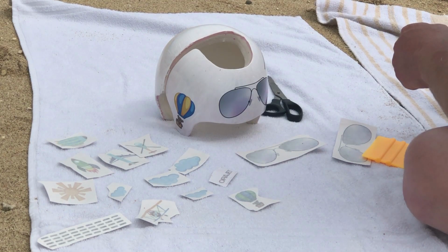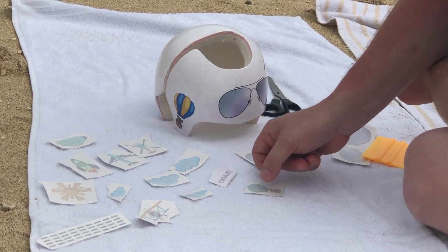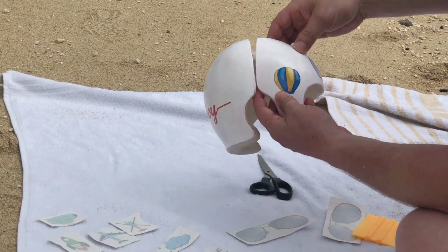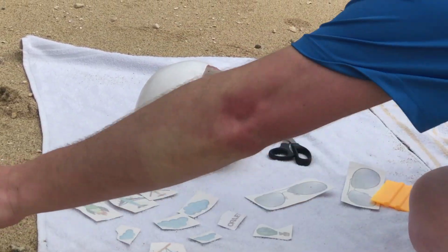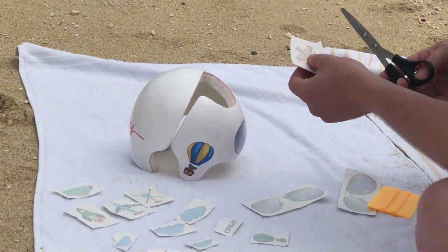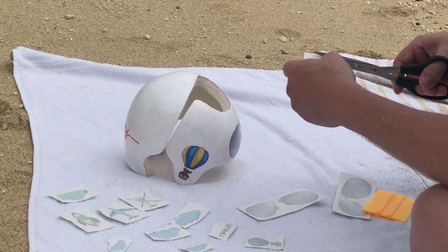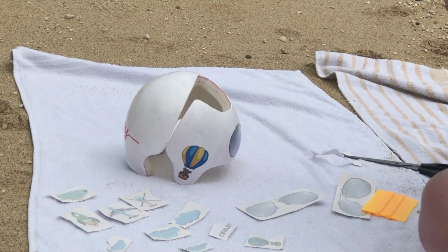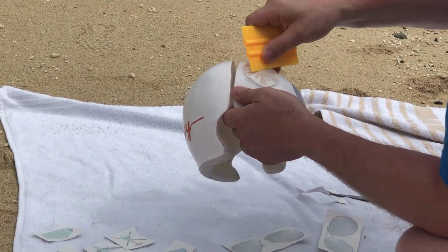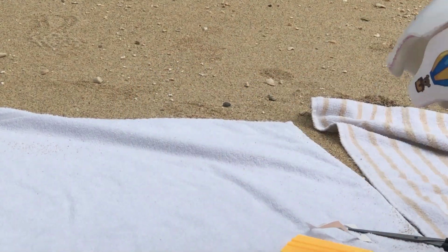Now let's apply some of the smaller details. Decal sets usually have more elements than can be used at one time. So I chose the elements I liked best and would look good together. I am going to speed up the video as I apply many of the smaller elements. I would keep the unused decals. You might use them in a picture scrapbook since they will match the theme of the helmet, or save them in case a design is damaged.